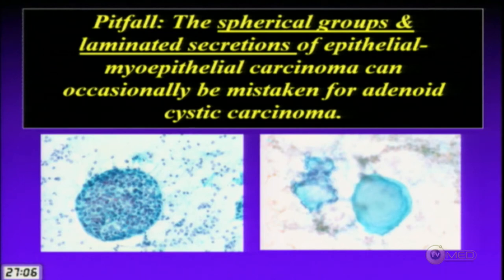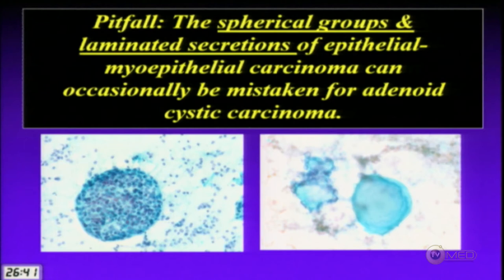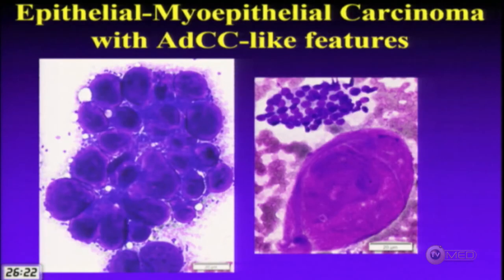A pitfall with FNA of epitheliomyoepithelial carcinoma is that features can raise concern for adenoid cystic carcinoma, which requires radical resection and often nerve sacrifice. Features of concern include large spheres of cells. Regarding secretions, the laminated proteinaceous secretion here differs from the homogeneous matrix produced by adenoid cystic carcinoma.